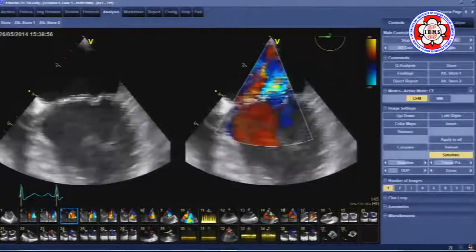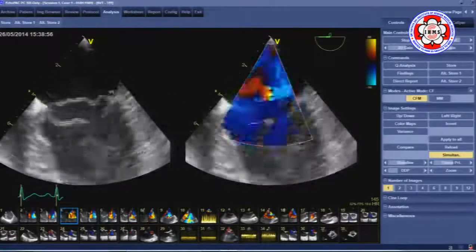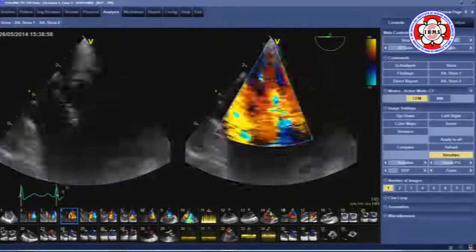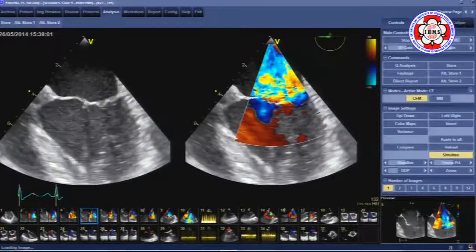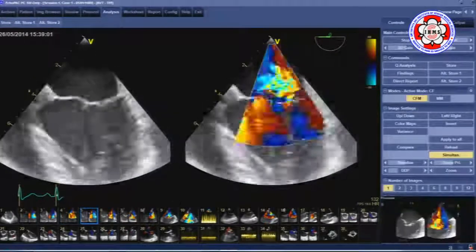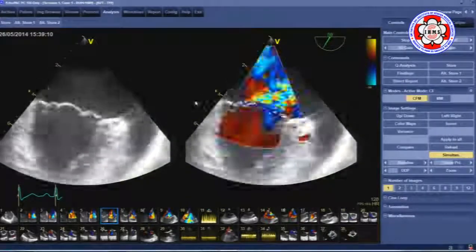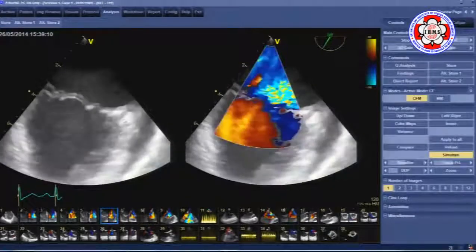now I'm at a lower esophageal view, I'm seeing A3 and P3. So from this mid-esophageal position, just based on how we adjust the probe, you can actually see all the different scallops. But there's another view that's very important. That's called the bicommissural view, and that's shown in this next image here. Here's your degree. So this is your 60-degree view. This is your left atrial appendage and your LCX here.